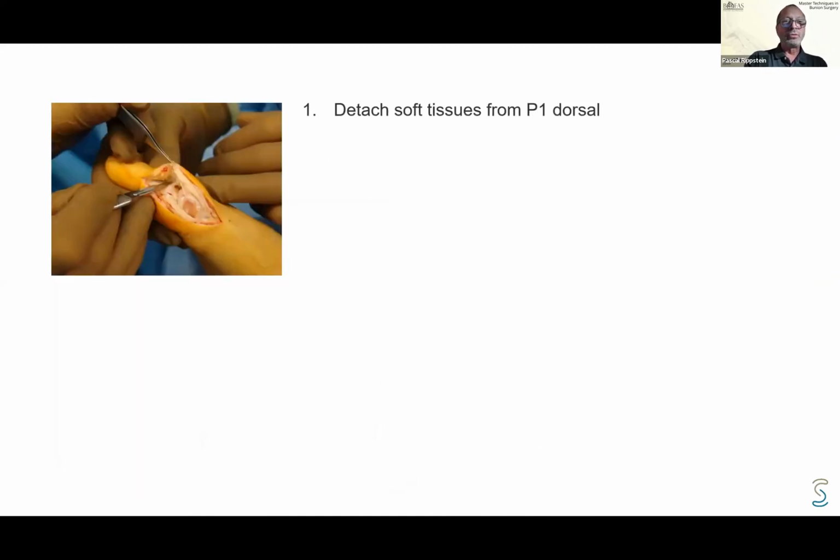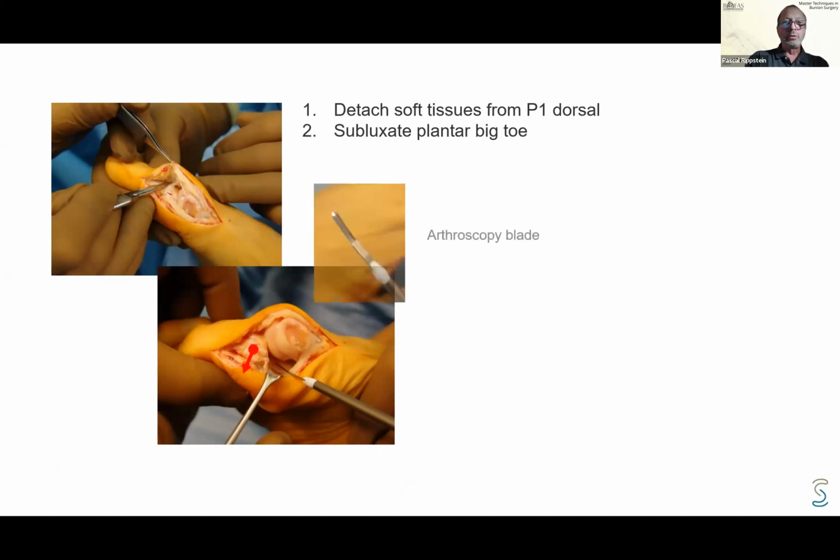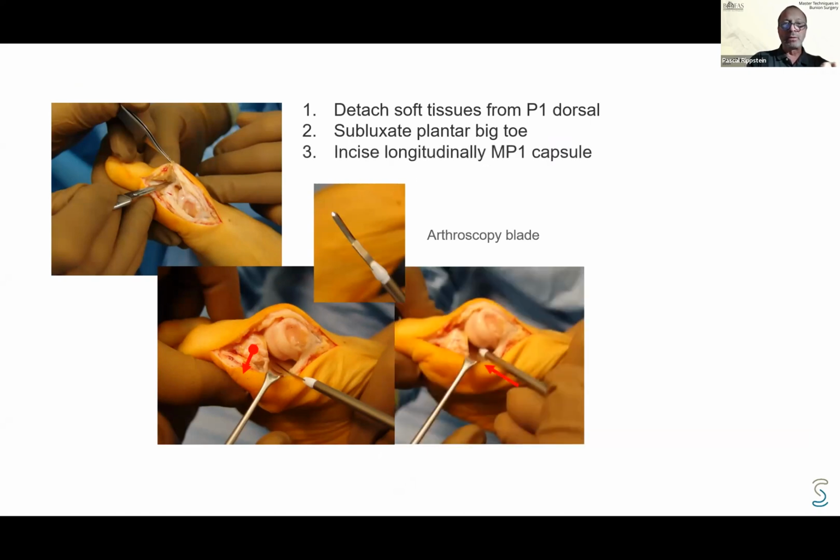I detach the soft tissue from the dorsal aspect of the phalanx. This allows me to luxate the big toe plantarly. Then I use a Beaver knife, which is cutting in front and the sides, it's slightly curved. I push this blade inside over the lateral sesamoid, performing an incision.